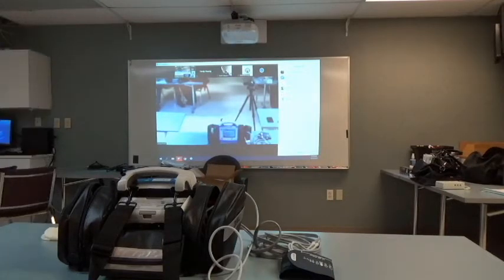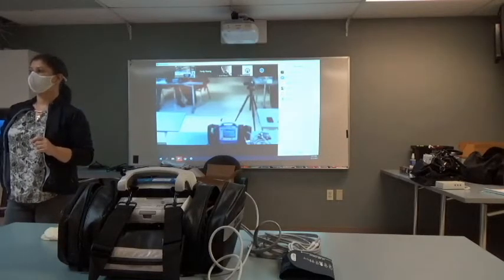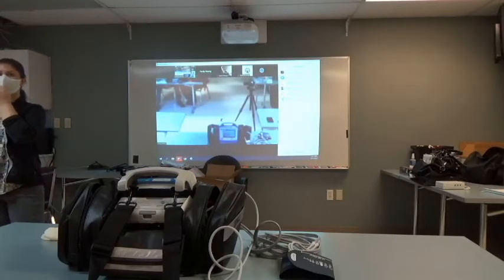I've got one more question up here and then I'll get to you. So if we change the interval, so we're going to make it 5 minutes, but if we decide we want it every 3 minutes or whatever, and we change it on that patient, when we turn it off and it comes back on, it's going to be every 5 minutes again. I think that's correct. Correct. Whatever the configuration file is, after the device is off for 2 minutes, it goes back to the master configuration file.